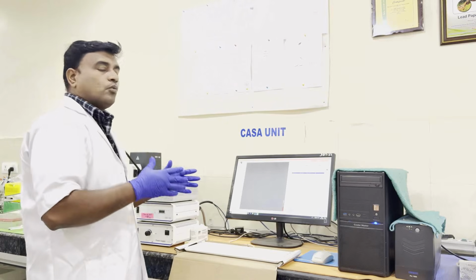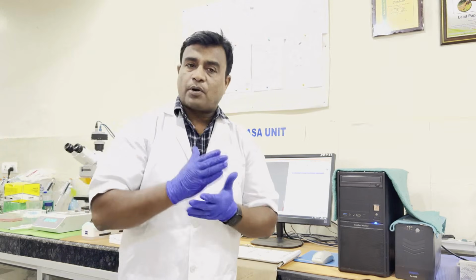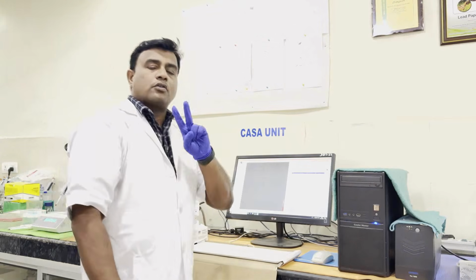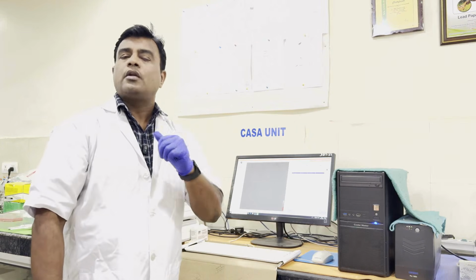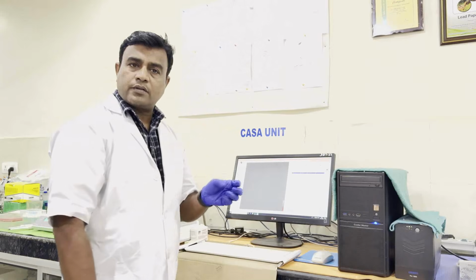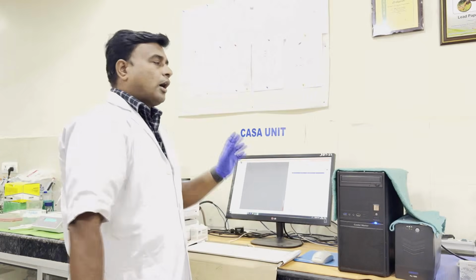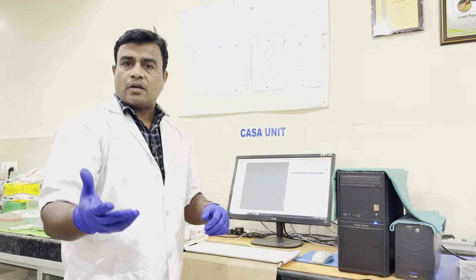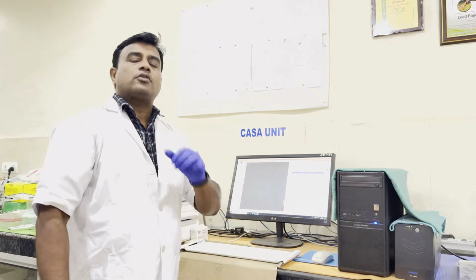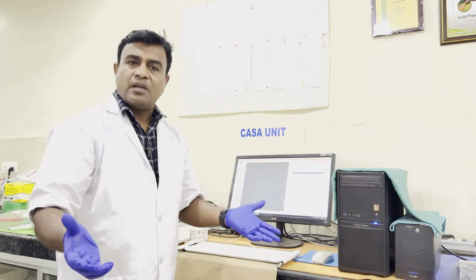Mostly, if you see, we use the CASA for motility and concentration analysis. So this particular part 3 will be focused on that. I will show you how to dilute semen, and what the quality parameters of dilution of semen are for CASA analysis. The third one is how to load the CASA slides. The fourth one, how to operate this interface. The fifth one, how to get the data and analyze the data.